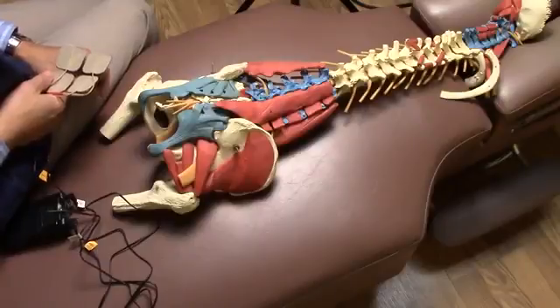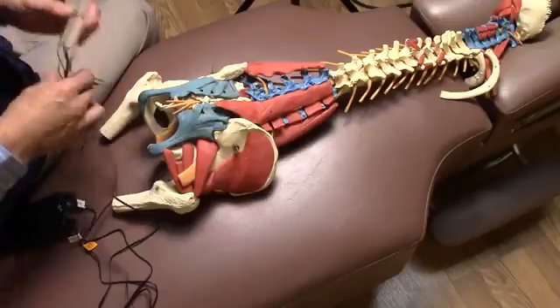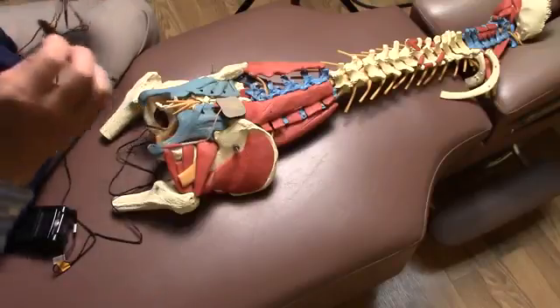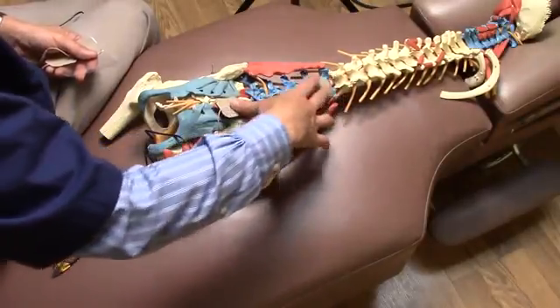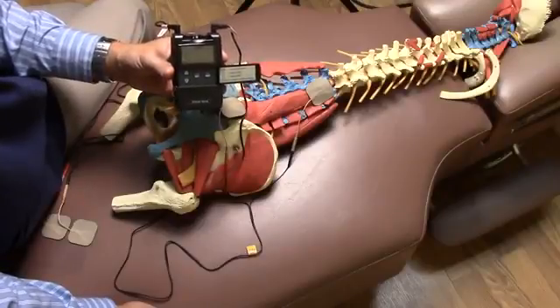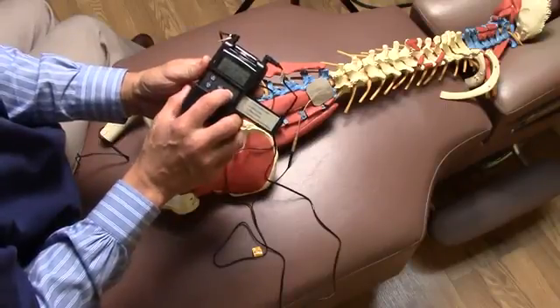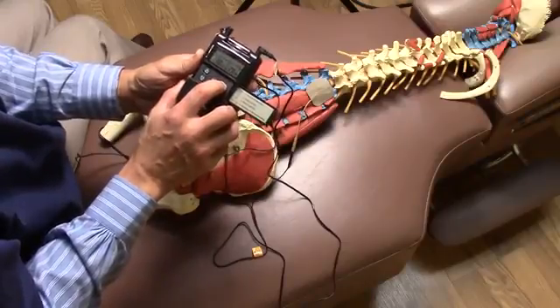If you have lower back pain and it feels like a muscle is spasming, let's say on the right side, then you could try this particular approach. Put 1 electrode on one end of the muscle, and then the other one on the top of the muscle. Go ahead and turn it on here. Most TENS units, this one included, come with pre-installed modes of operation. This one has burst mode, normal, modulation, SD1, and SD2.